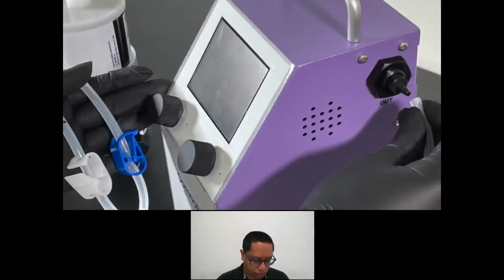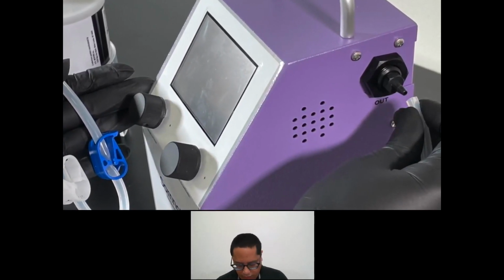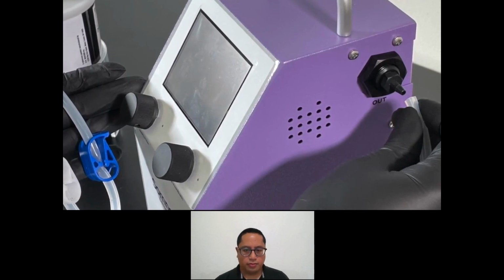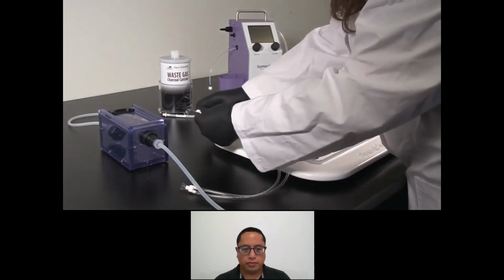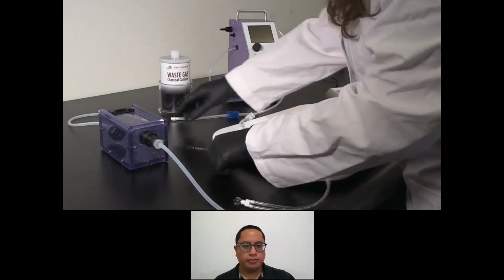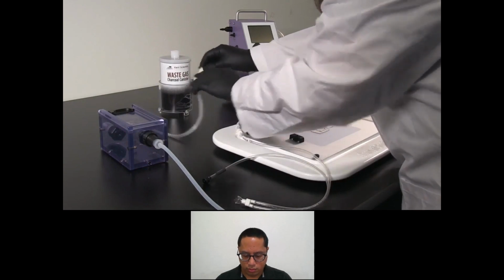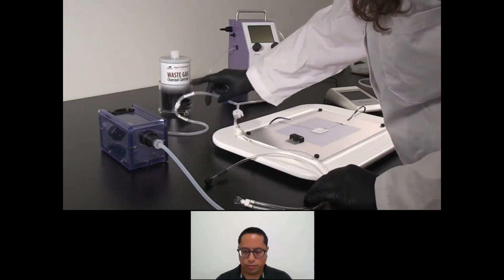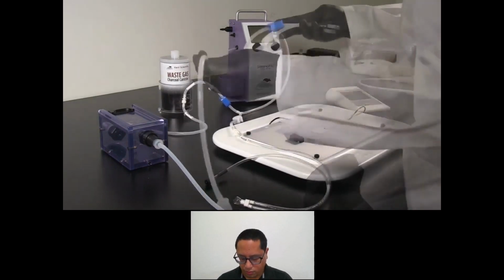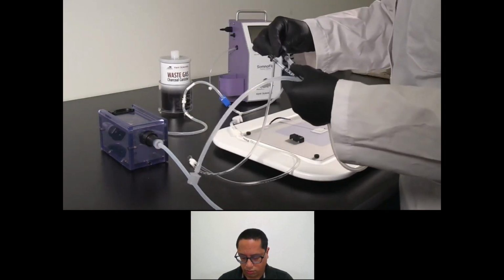To begin setting up the SomnoFlow, connect the inspiratory portion of the 2 accessory connector to the SomnoFlow's port labeled out. Connect the inspiratory portion of the face mask tubing to one branch and the inspiratory chamber tubing to the other branch. Connect the expiratory portion of the 2 accessory connector to the expiratory tubing on the chamber and nose cone.